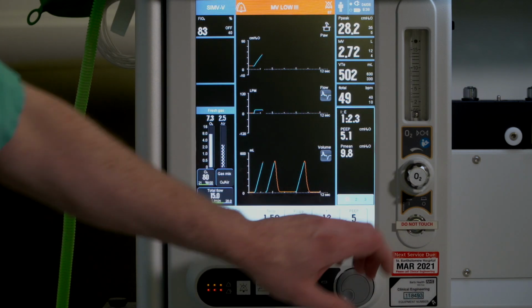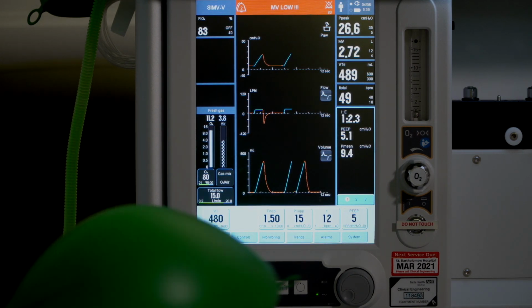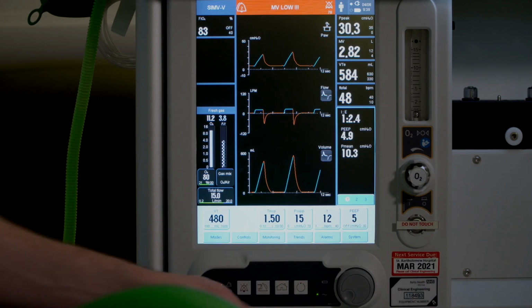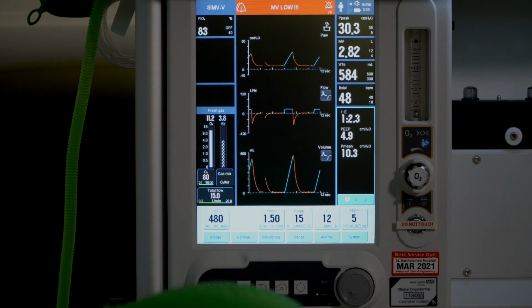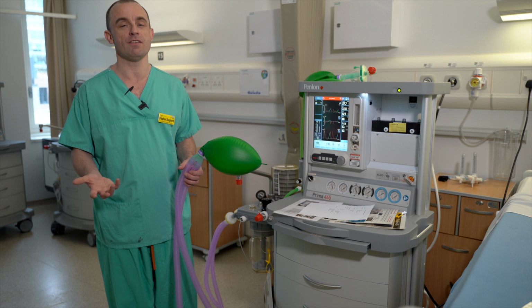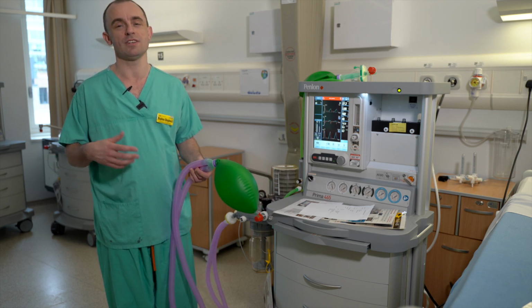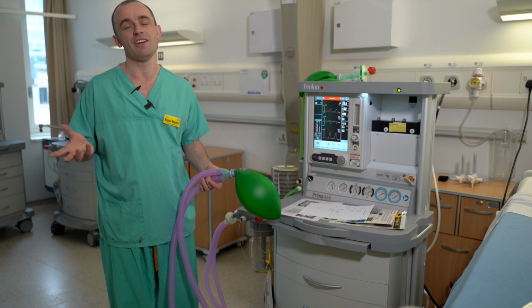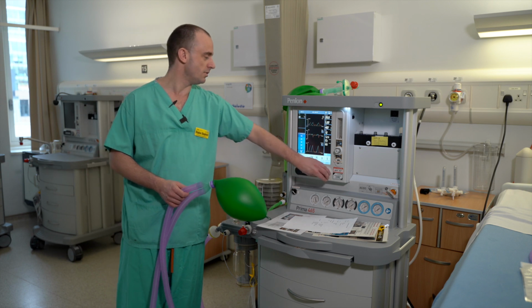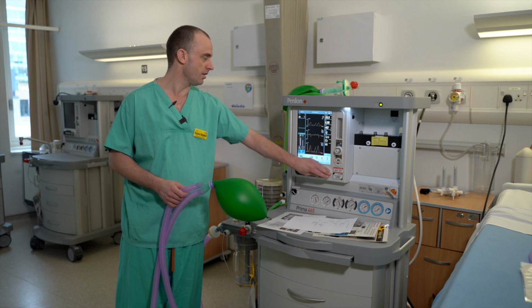The maximum gas flow that you can get through this machine is 20 litres, but you cannot give more than 15 litres of either oxygen or air. So, for example, if you want to give 15 litres per minute of oxygen and 5 litres per minute of air, the maximum FiO2 that you will get will be somewhere in the region of around 75 to 80%.